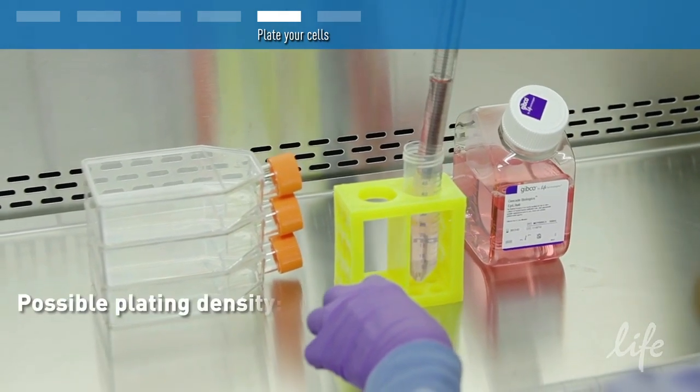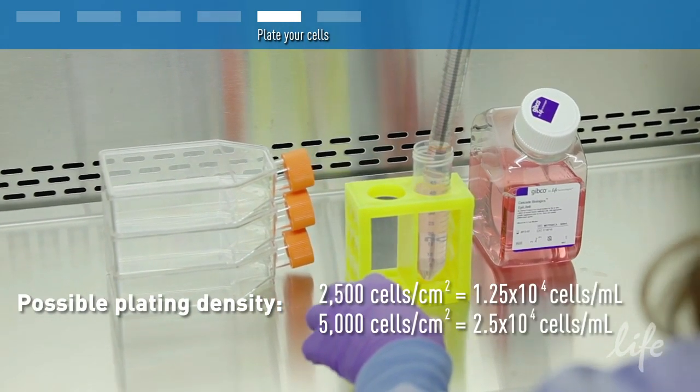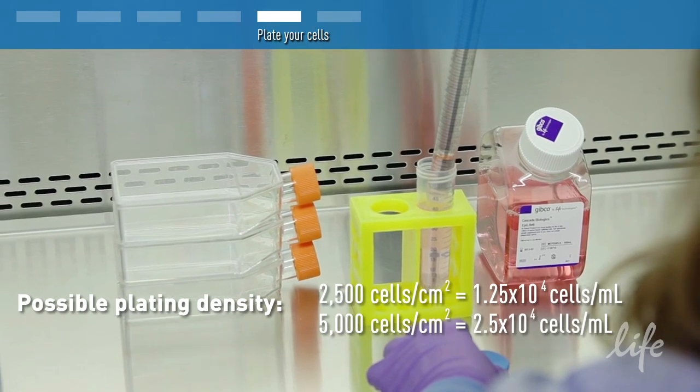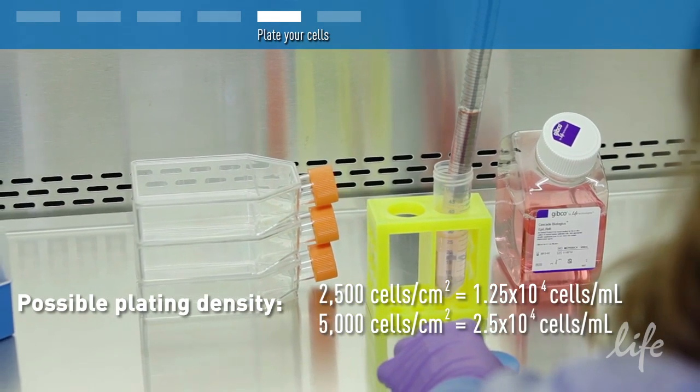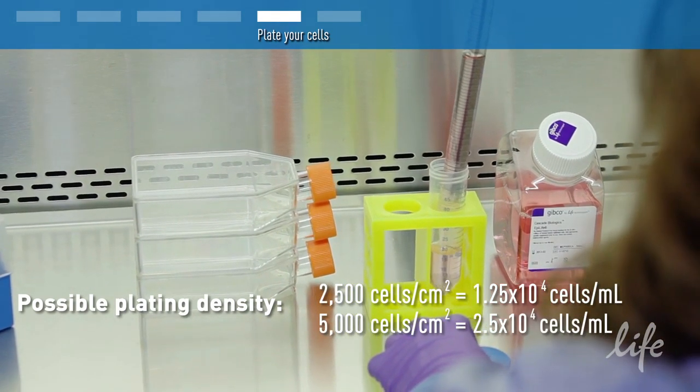Finally, use the supplemented media you prepared earlier to dilute the cells to the recommended plating density. This is typically 2,500 to 5,000 cells per centimeter squared.